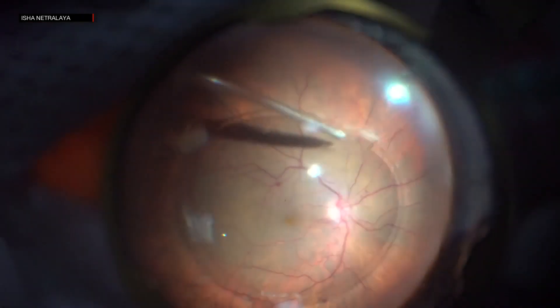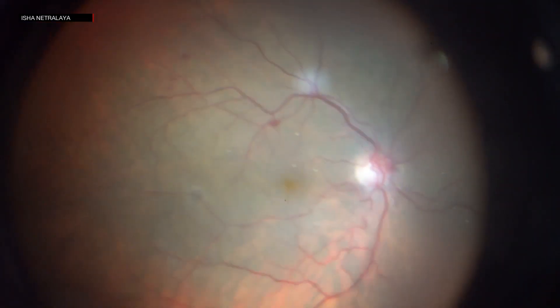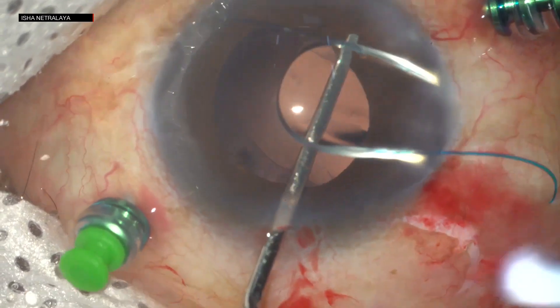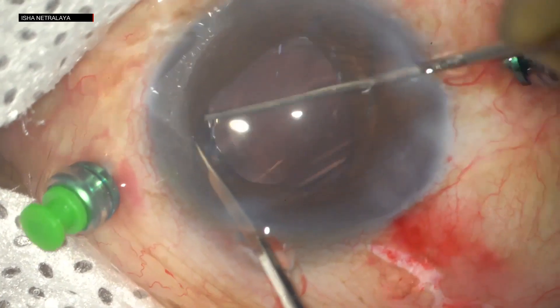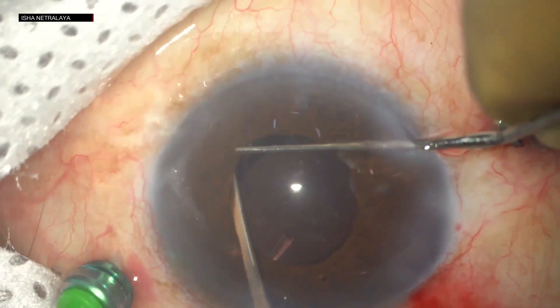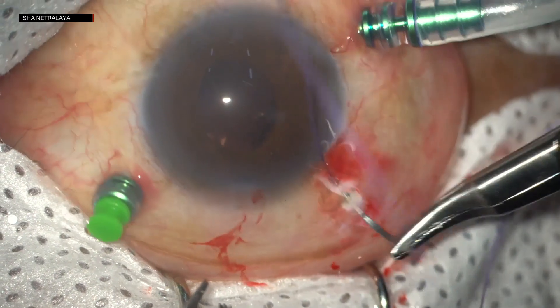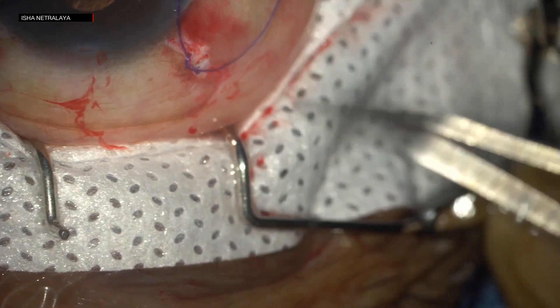Vitrectomy was used to take care of the smaller pieces. PFCL was aspirated. A 3-piece foldable intraocular lens was placed in the sulcus.